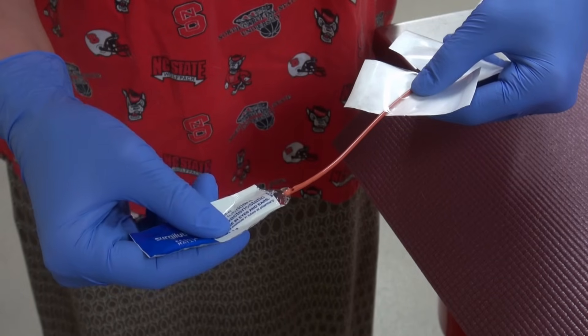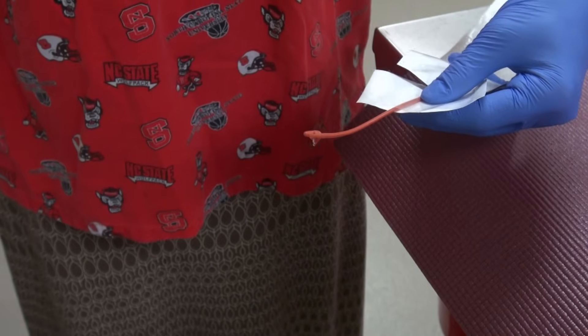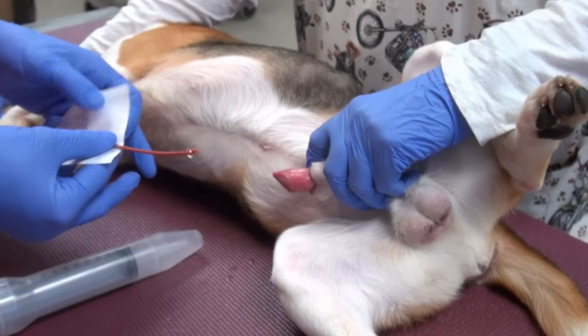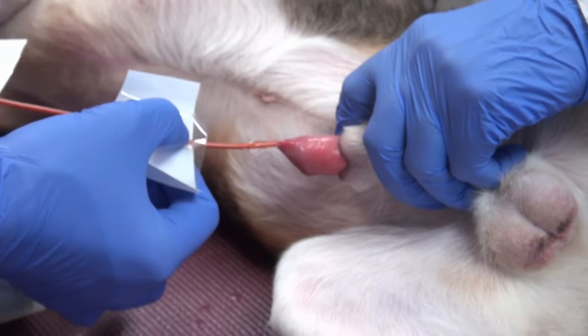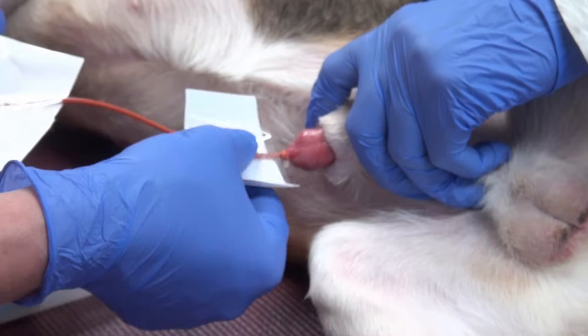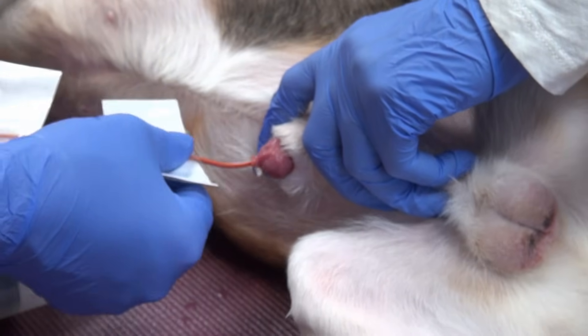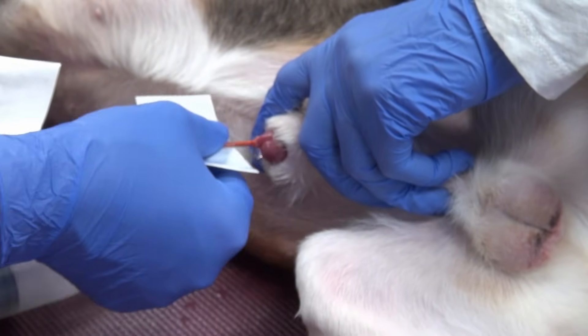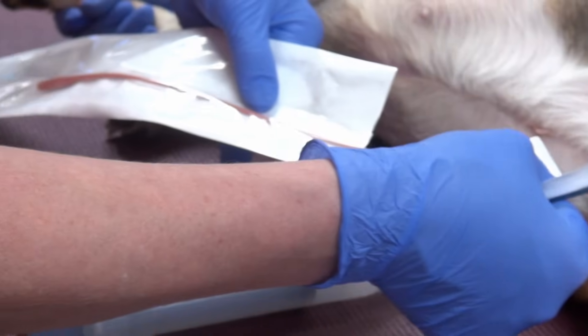The catheter tip is lubricated with sterile water-soluble lubricant and then introduced into the tip of the penile urethra. The movable piece is used to grasp and advance the catheter one to two inches at a time, and it is advanced to the level of the pubic bone. If you are not sure how far that is, you can ask an assistant to hold a second, unopened catheter alongside to gauge how far it has advanced. Once the tip of the catheter enters the bladder, you may see urine flowing into the outer wrap, as it is here. That is your signal that the catheter has advanced far enough.